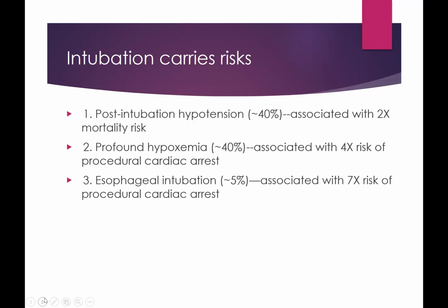Now, you'll notice this is roughly around 5%. And to be honest with you, this is something that I really haven't seen very often. I've seen it a handful of times, and the majority of the time, if I'm treating somebody who has had an esophageal intubation, it's coming from an outside facility, or when I used to work in the emergency department, somebody who was esophageally intubated in the field or in a moving vehicle with EMS. At least in my clinical practice, I really haven't seen too many esophageal intubations occur in the ICU setting, which is good because an esophageal intubation, while not that common, is associated with 7 times the risk of cardiac arrest during an intubation.